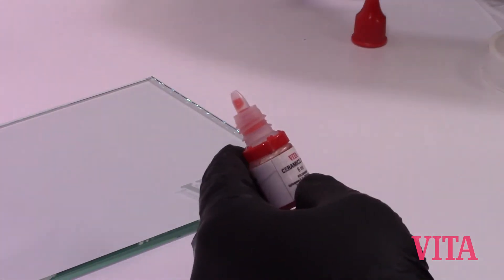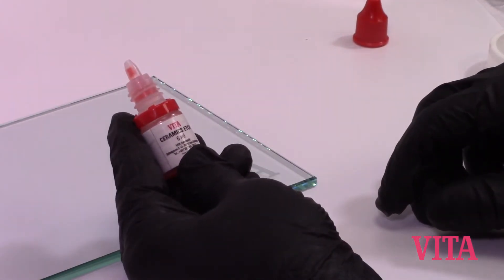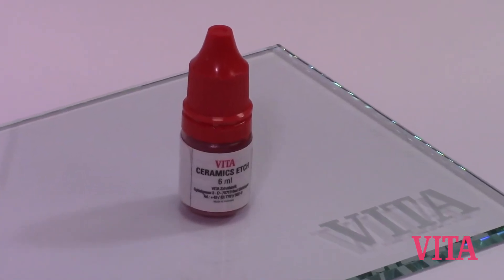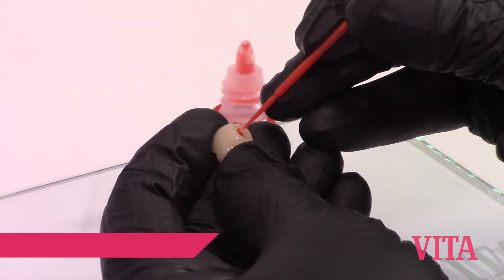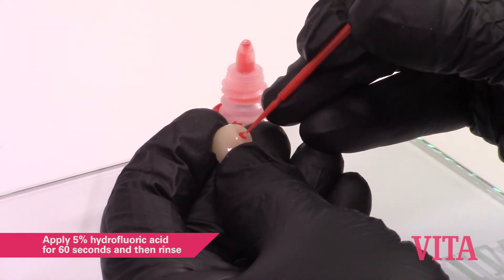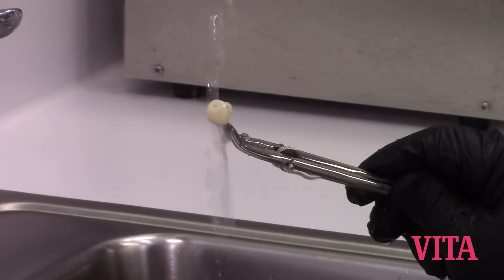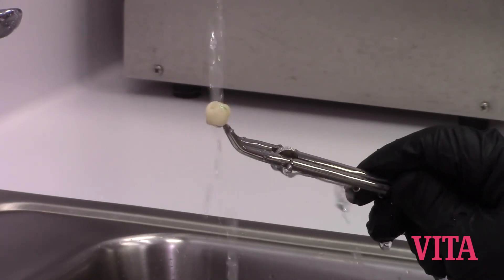Using hydrofluoric acid — in this example, Vita Ceramics Etch, 5% hydrofluoric acid — apply the etch to the inside, or the intaglio, of the restoration. At the 60-second mark, rinse the hydrofluoric acid out of the restoration.